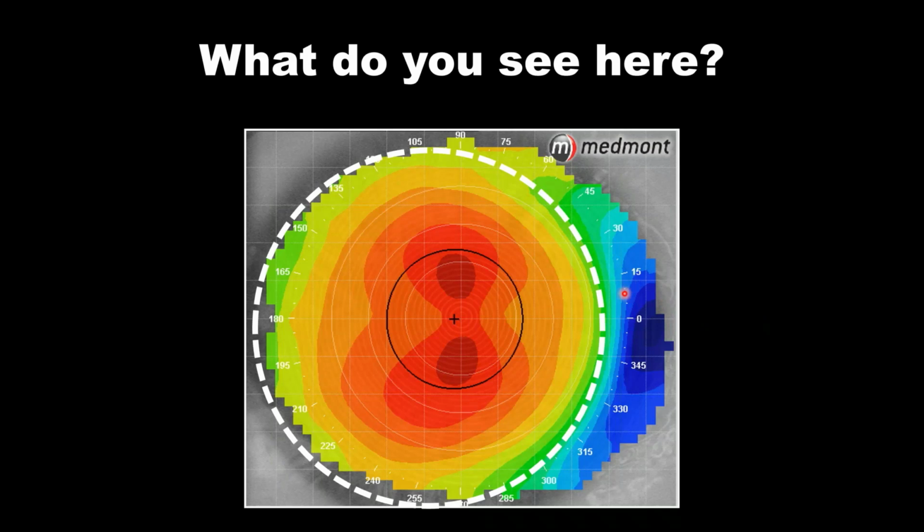The Medmont shows you much more data on the nasal side because of our patient's fixation. The temporally displaced fovea results in our patients fixating slightly temporal as they look down the axis of the instrument. So that causes the topography to be skewed or favoring the nasal side.